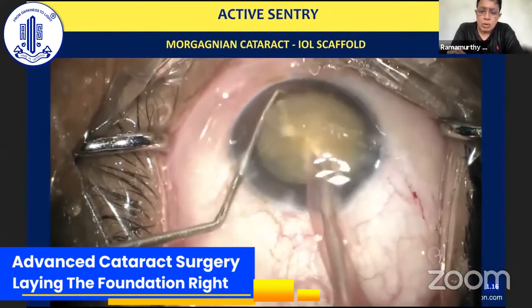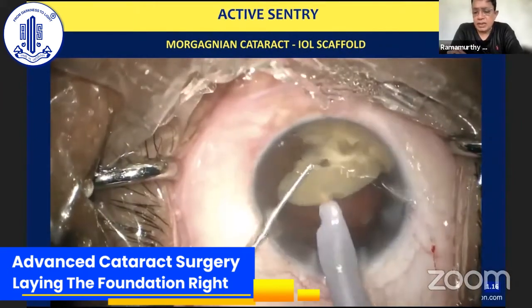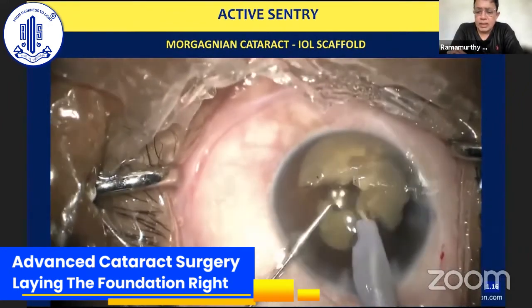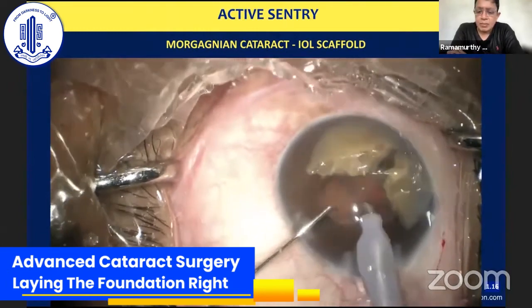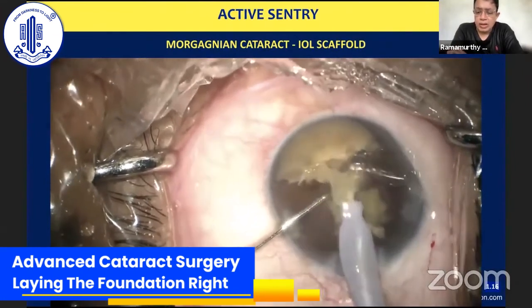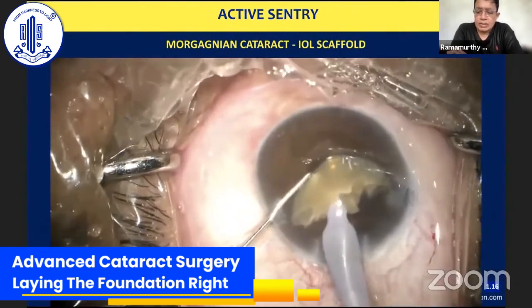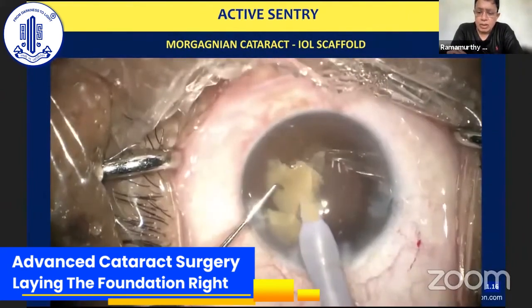But at the same time, it's not continuous application of the phaco. Unfortunately, the phaco settings are not seen here, but you have to take my word that the active fluidics with Active Sentry is in use. Basically, even in this, there's a right amount of changeover from foot position 2 to 3. And the phaco power is used only when it is necessary. And you can see the removal of the nucleus happening in a methodical manner.